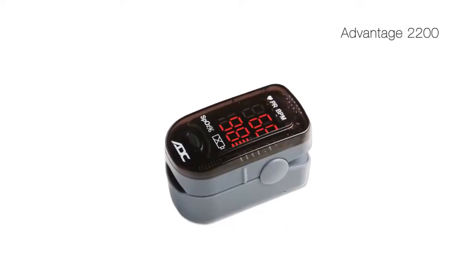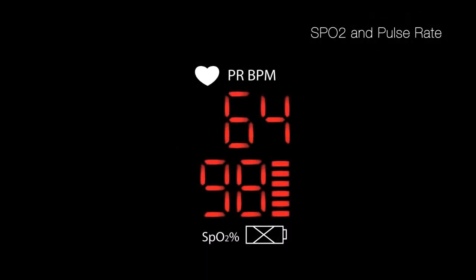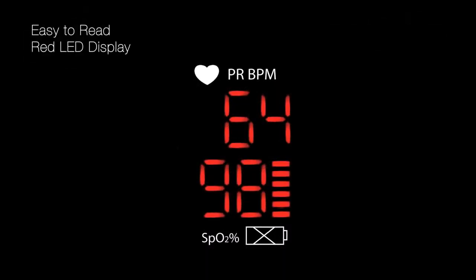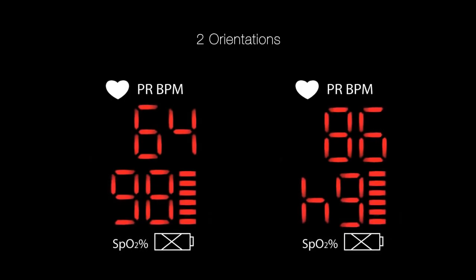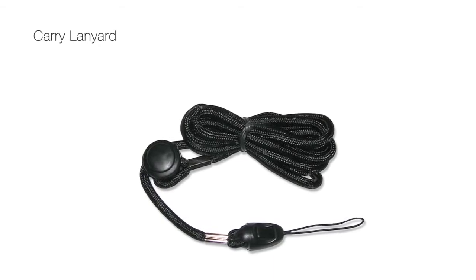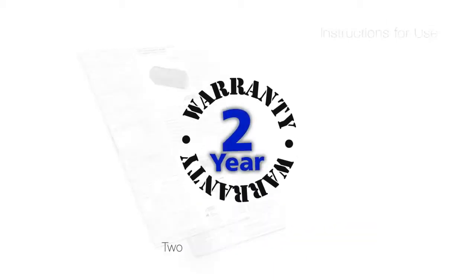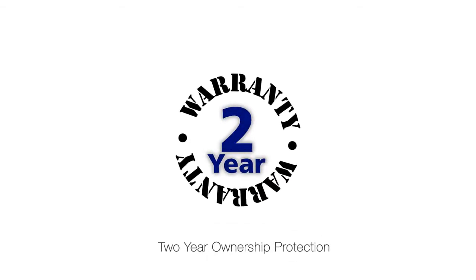The Advantage 2200 is designed for measurement at home. It's the instrument of choice for the patient that needs to monitor their SPO2 values, or the sports enthusiast that wants to bring their fitness to the next level. And to protect your investment, ADC fingertip pulse oximeters are backed by some of the industry's most comprehensive warranties.